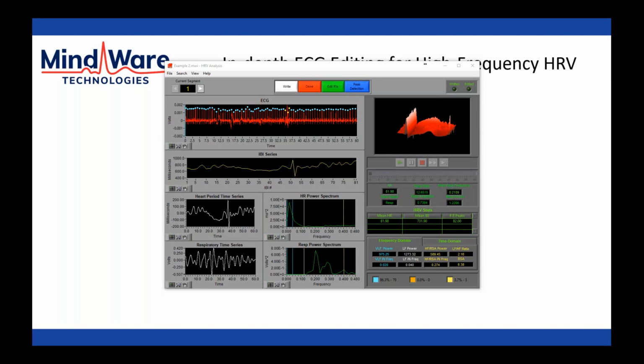But what I would rather you do is look at that 10-minute period, but do it in 60-second chunks. Because when you do that, you have the option of discarding that minute in the middle and not impacting the calculations performed on the other 9 minutes of interest. And then in your higher level statistical analysis, whether you're doing it in Excel or SPSS or R, or wherever, you would just take the average representation of however many segments you had from that period as indicative of the whole period. And the one missing segment would not require you to discard that 10-minute period. So that would be best practice.